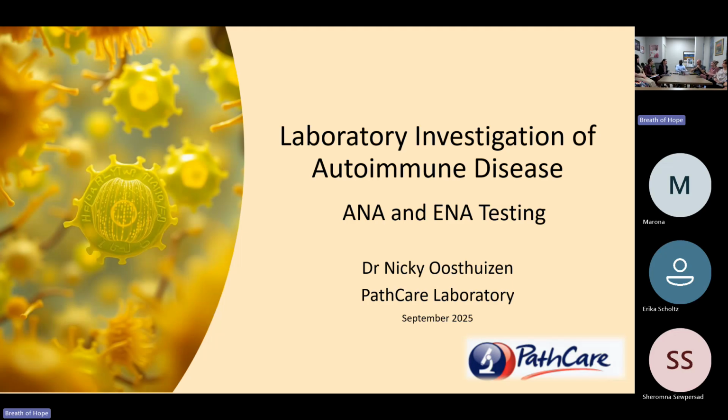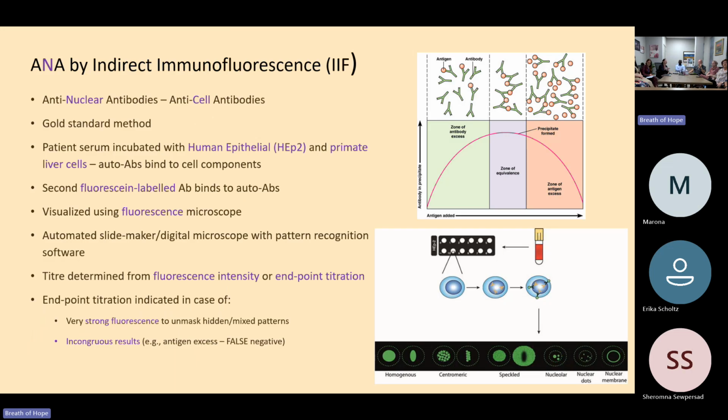Thank you very much for the welcome and the introduction. Okay, so my talk today is going to focus on ANA and ENA testing in terms of laboratory diagnosis. It's quite a big topic, so it's going to be more of an overview of the whole topic.